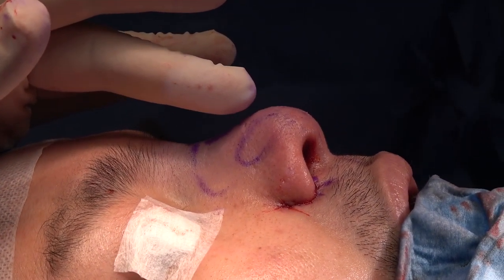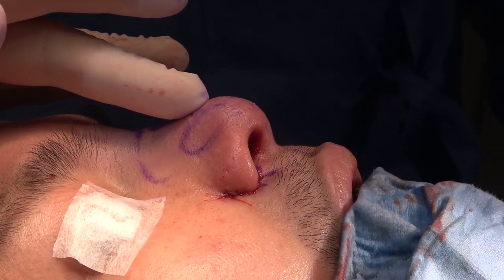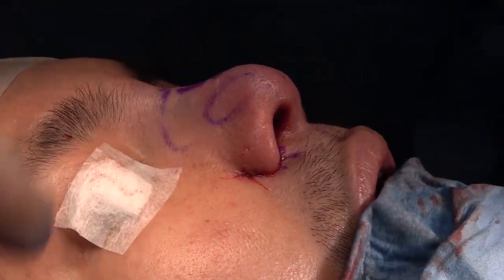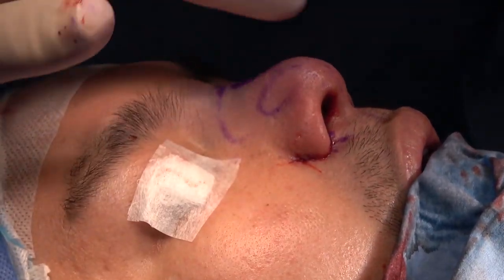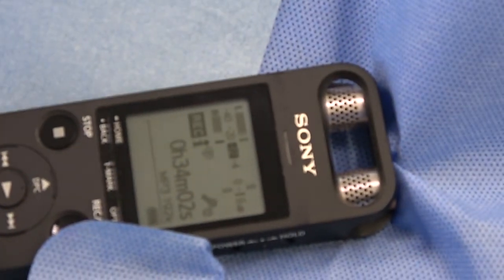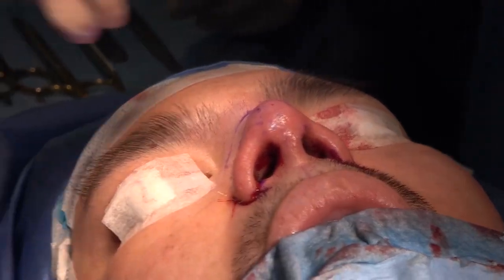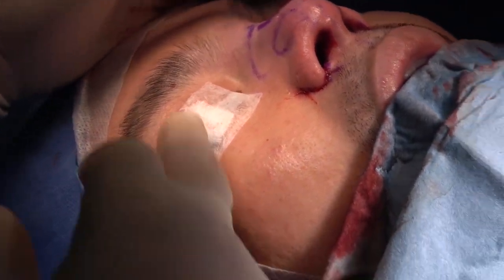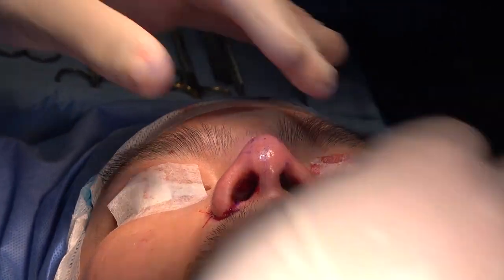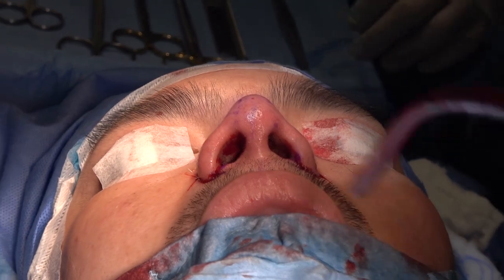So oblique dome division, columellar strut, four tip grafts, alar wedge resection, obtaining conchal graft, doing septoplasty, dorsal grafting, all done in less than 35 minutes. Full augmentation rhinoplasty on patients from Southeast Asia with the use of the septal graft, conchal graft, and dorsal homograft. So quite a nice result. See the big difference between before and after.